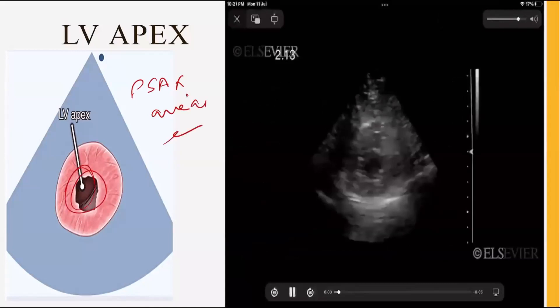The PSAX view at the LV apex level is used to check whether the LV apex is empty or contains a thrombus.